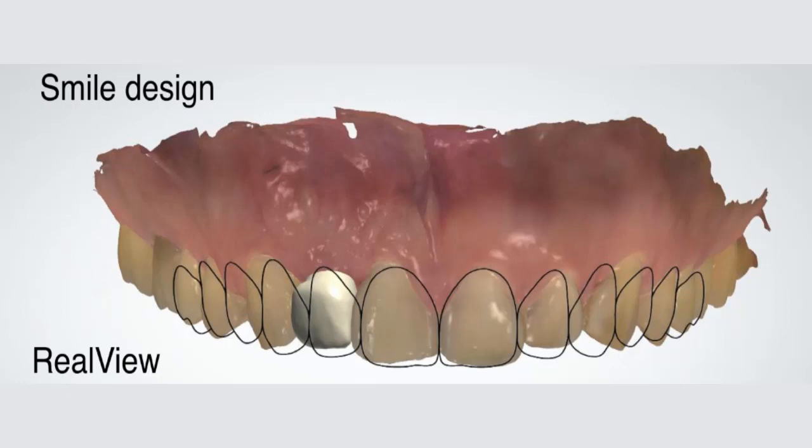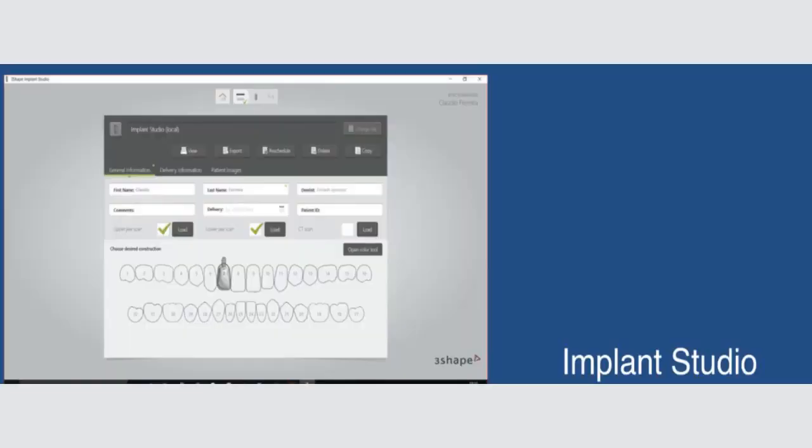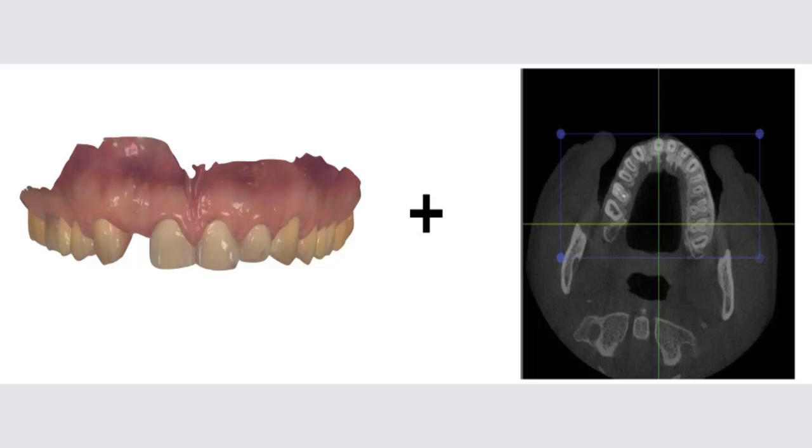But here's our patient. I designed and showed him some design, and the patient was not looking into changing some of the composite. You're going to see as we move forward here. I immediately started making the treatment plan using Implant Studio. So here was one of the first cases I have done. It's a pretty straightforward process. You open up the software, then you select what exactly you're looking for, and after that, you incorporate the scan plus the CBCT, the DICOM files from the CBCT.